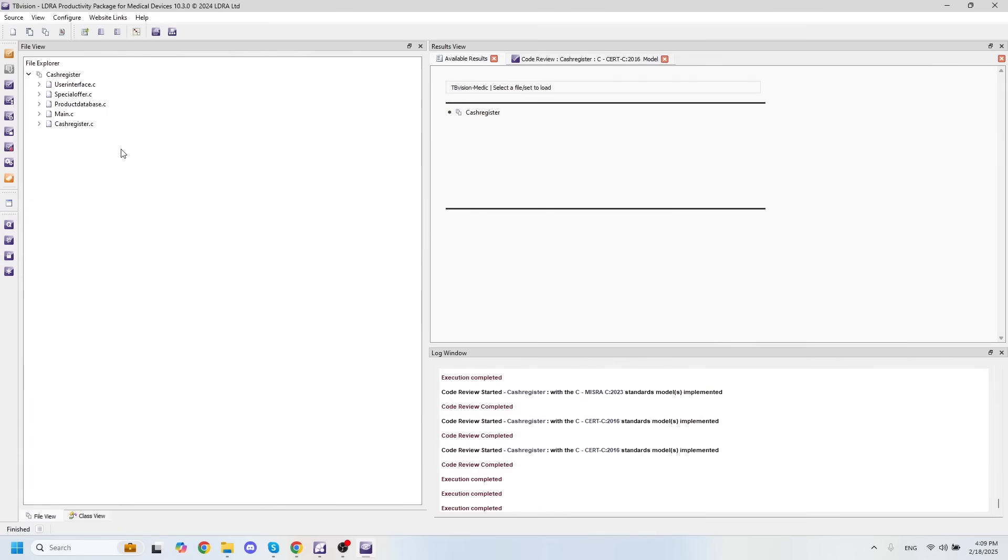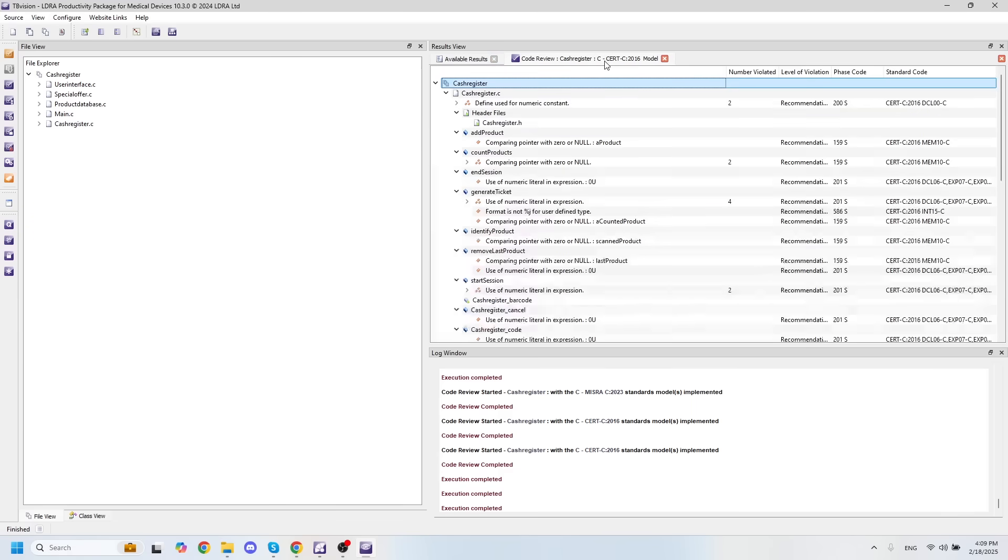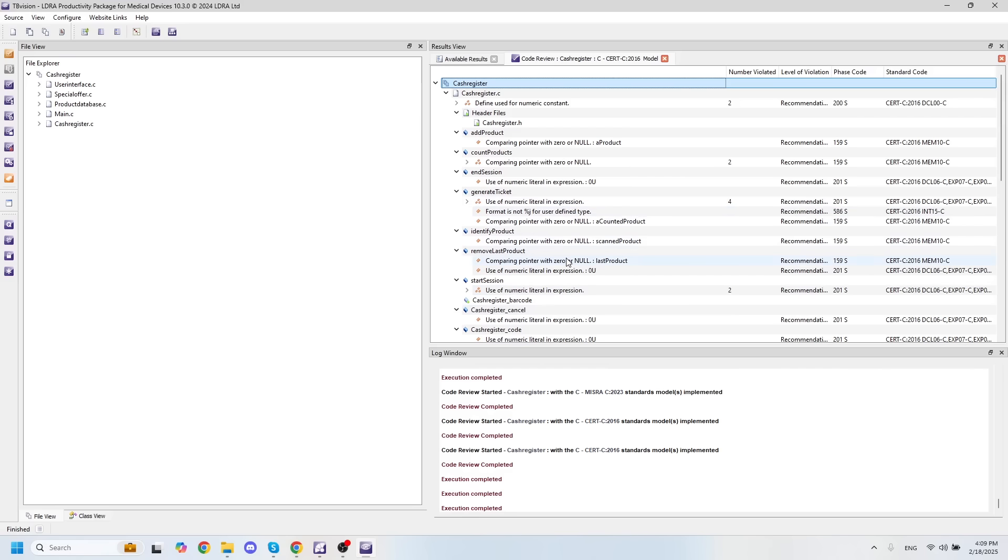For this set, I've actually already ran static analysis against the Cert C 2016 coding standard, and we can see I have some violations here associated with my code.